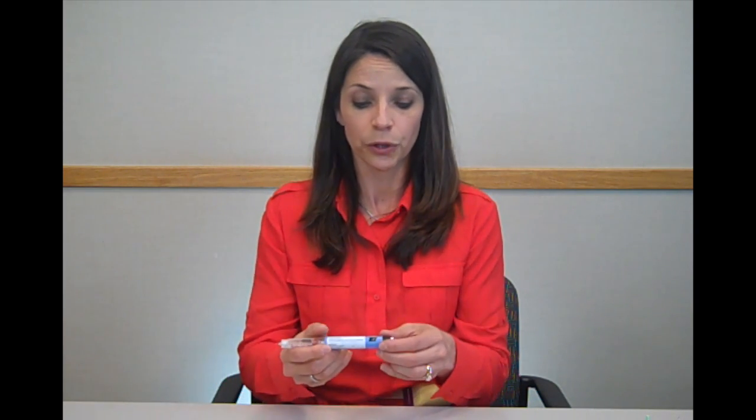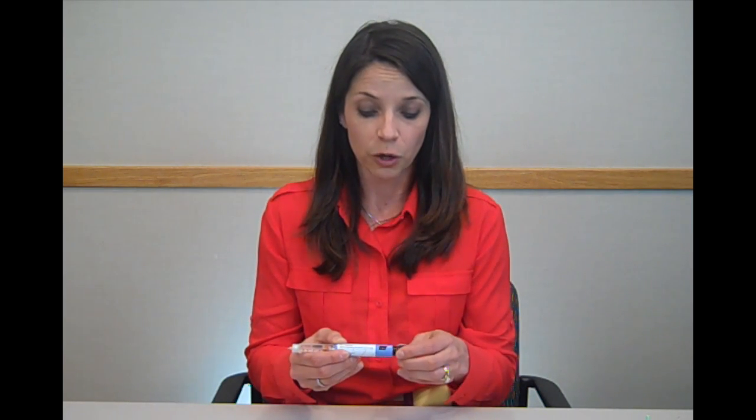Next, you can dial up your dose. This pen has three doses. You want to make sure that you select the dose that was prescribed by your provider. If you go past your dose, it's okay for you to dial back down to the correct dose. Once you have selected your dose, you want to make sure it lines up with the dose marker.